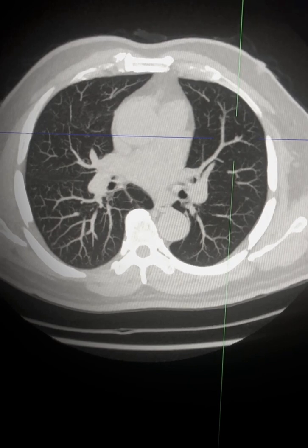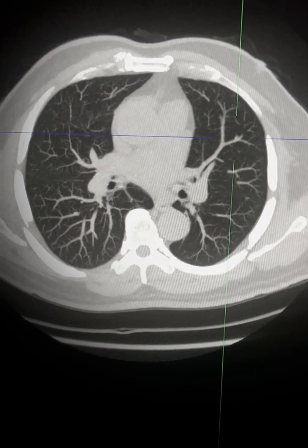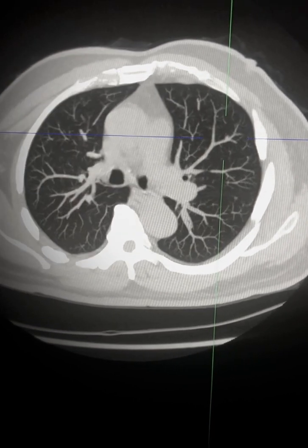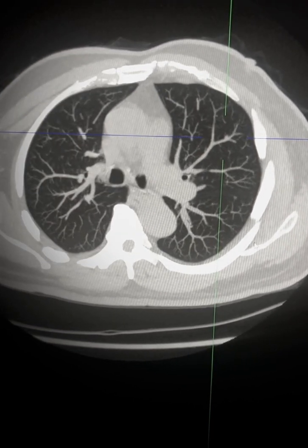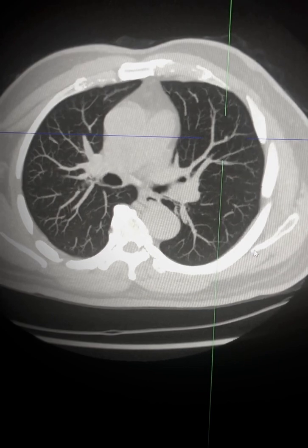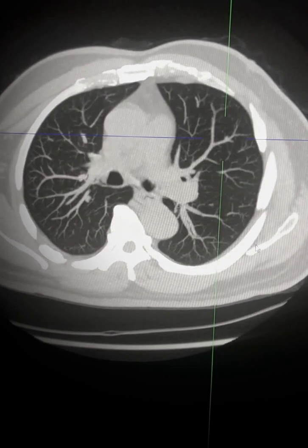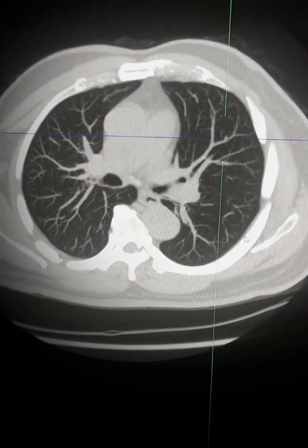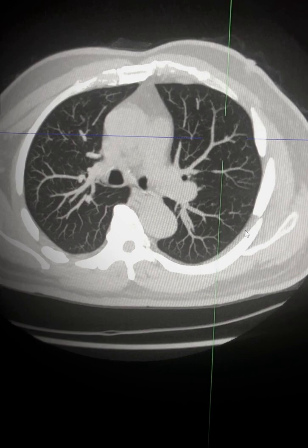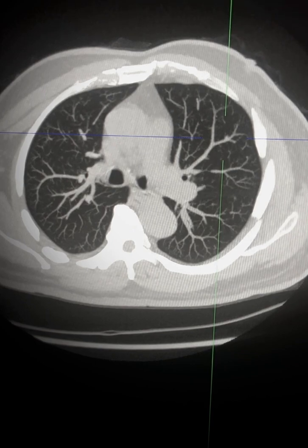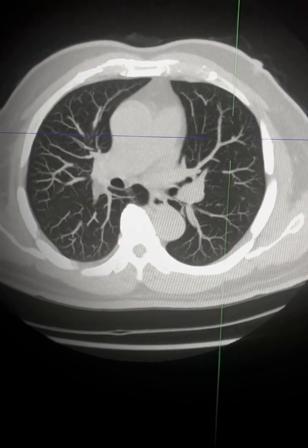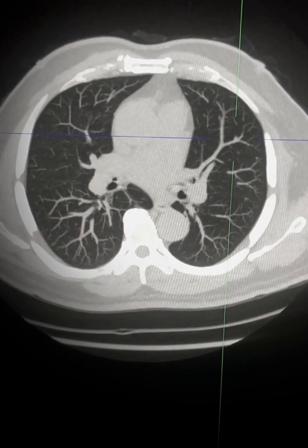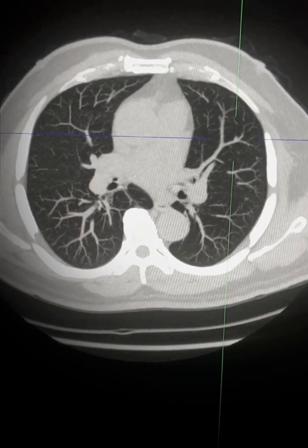Once this is done you can also use your other rotating tools and scroll in slightly altered rotation planes to make sure that it is not part of a vessel. Once you are confident you can hone in on the location and revert back to your normal setting.